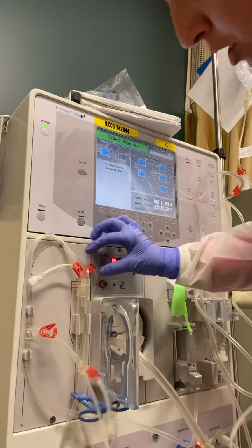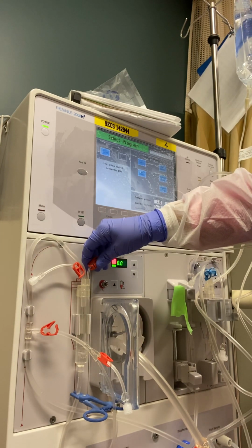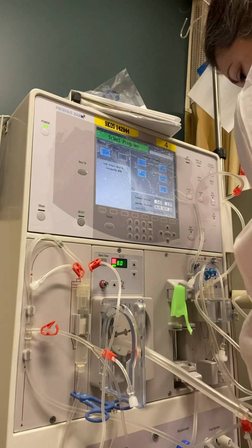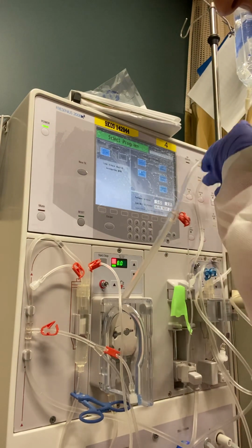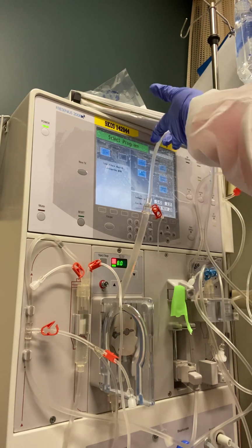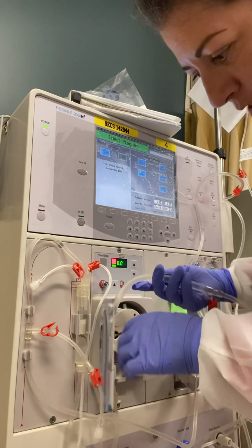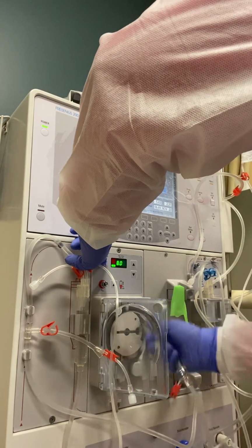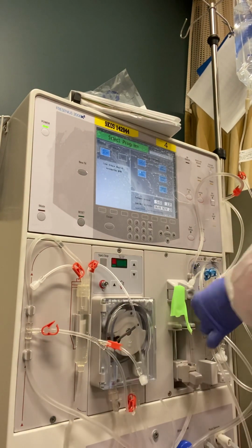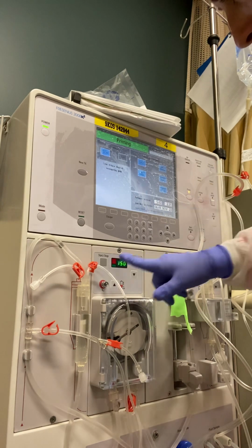So now I'm going to fill the drip chamber by unclamping the transducer line until it gets to the fill mark. Okay. Now I'm going to prime the blood segment tubing and dialyzer line by unclamping this. Alright, as soon as that hits the dialyzer, I'm going to thread my blood pump segment. Now I'm going to make sure that the pump is set to 150 and hit prime and start the pump.